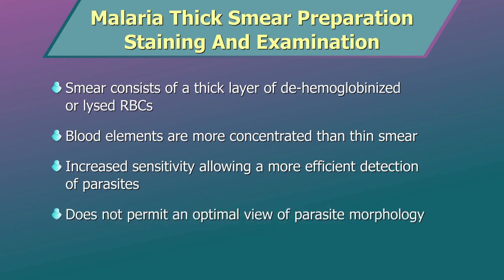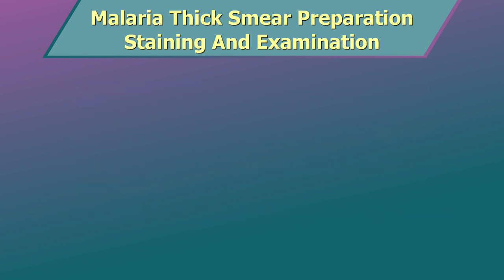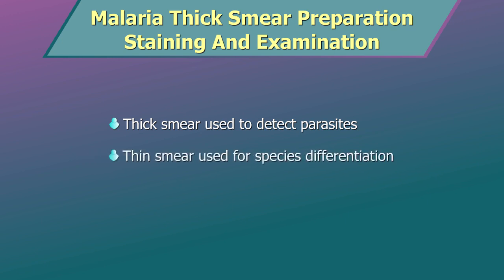However, they do not permit an optimal view of parasite morphology. For example, they are often not adequate for species identification of malarial parasites. If the thick smear is positive for malarial parasites, the thin smear should be used for species identification.